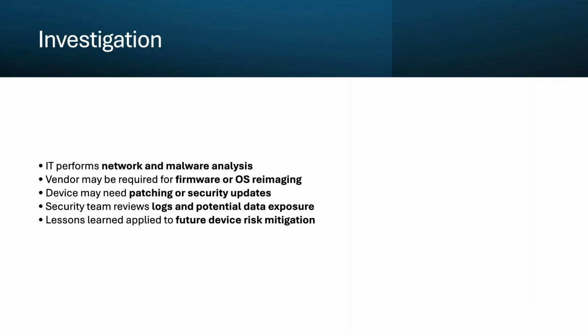Our security team conducts a thorough review of logs and potential data exposure. We need to understand what data may have been accessed or compromised, which is critical for regulatory reporting and patient notification if necessary. If protected health information was exposed, a HIPAA breach notification requirement may be triggered.